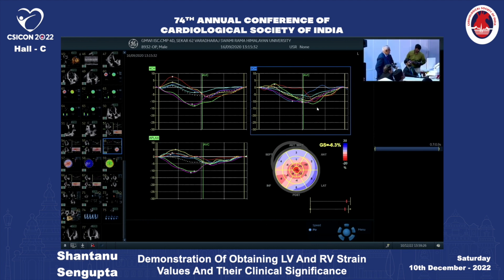All right. As we all said, the whole contraction or all waves should be at the aortic valve closure, but sometimes a few of the waves can go beyond the aortic valve closure, which is called post-systolic contraction. So this wave, can you see this? The green one is peaking after the aortic valve closure. Would you like to say something on that?